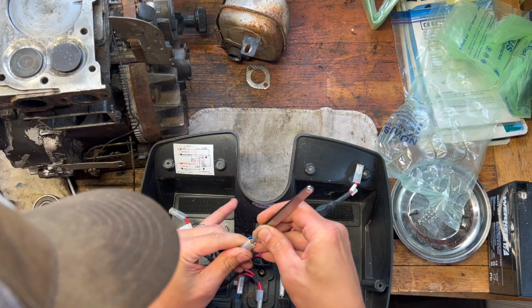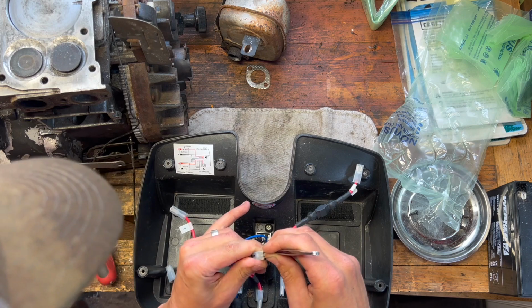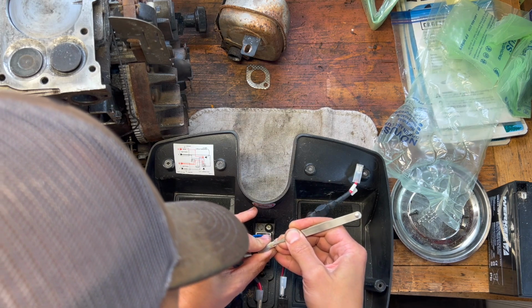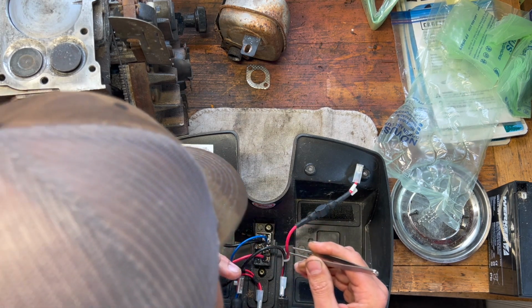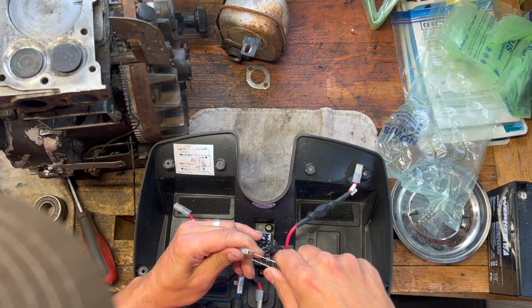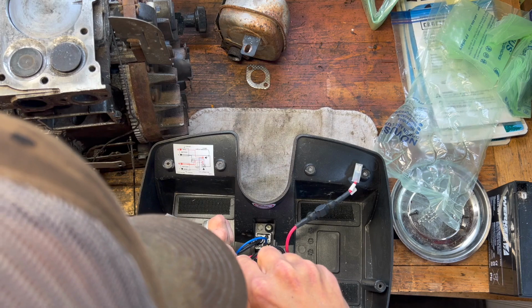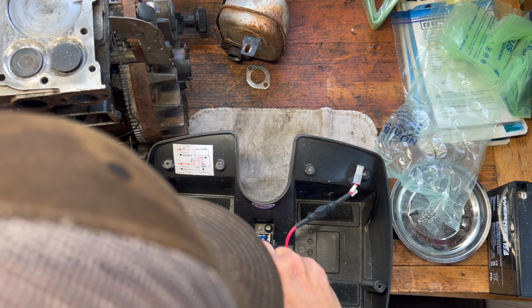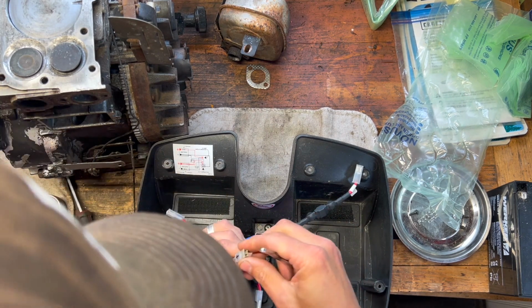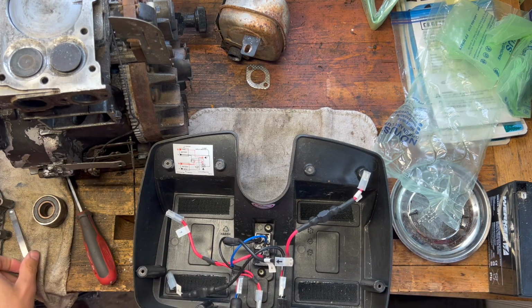So I was reading that you can, so this is a 12-volt system, right? So theoretically you could set up a car battery or a riding lawnmower battery and try to run it that way just to test it. But I didn't have any mower batteries offhand, which is kind of rare for me. I usually like to have at least one handy.